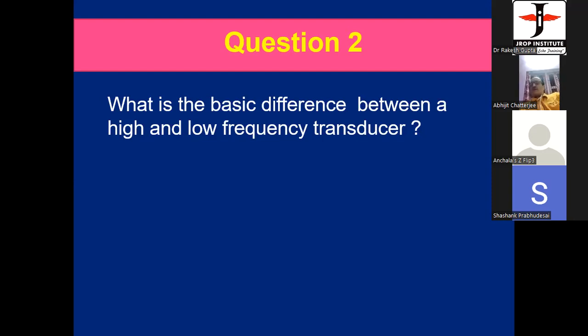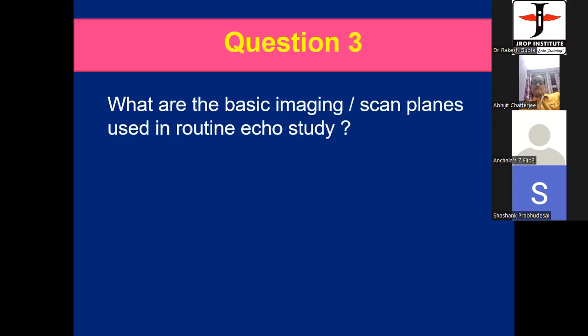What else? Better penetration, better Doppler studies. Yes, sir. And what is the side effect of a low frequency transducer? Poor resolution. Near resolution is poor. Yes, sir.